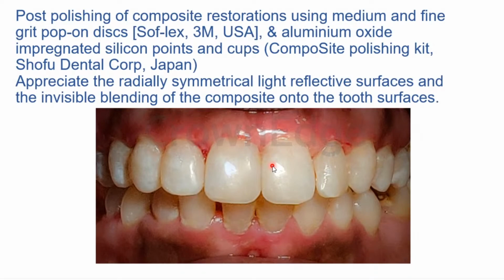So these are the different adhesive components, right from fourth generation, like your Optibond or Scotchbond Multipurpose, with three bottles, phosphoric acid, primer, and an adhesive being different.